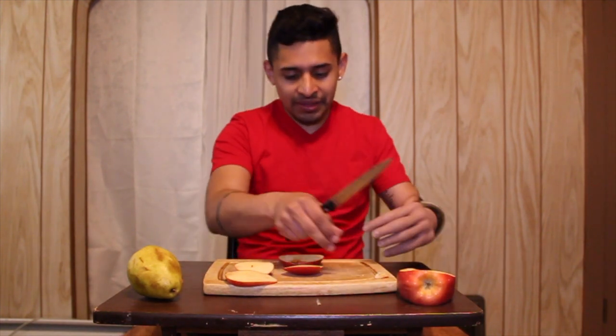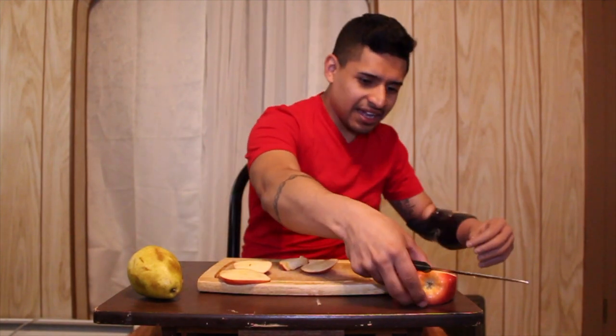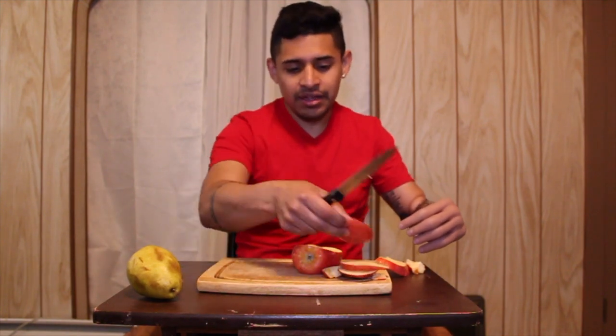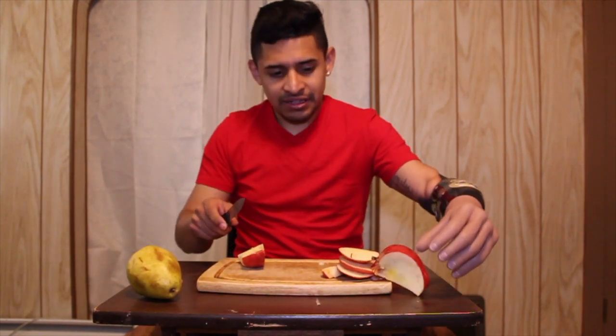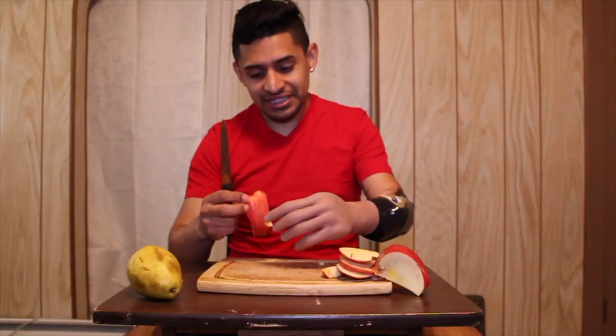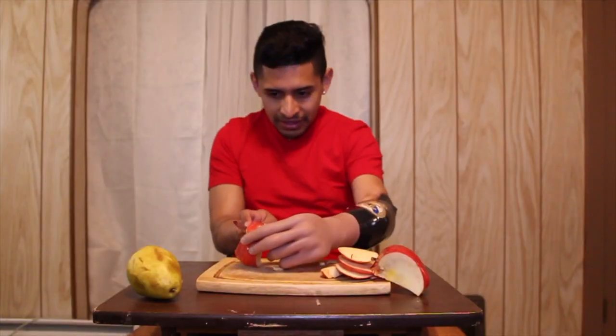It's gonna be hard. I have to grab it like that — I'm cutting the wrong side. Grab it, oops, let me cut it again. Oh, I cut them wrong. It's kind of hard, but it's funny — when you grab it, it fell down. This apple is hard to grab. Damn it.